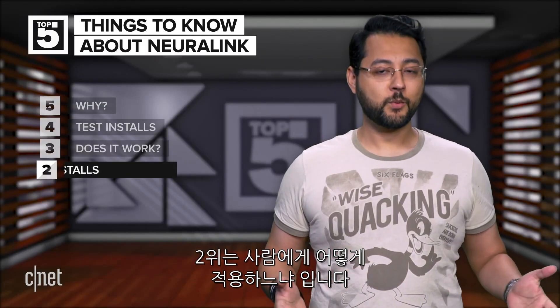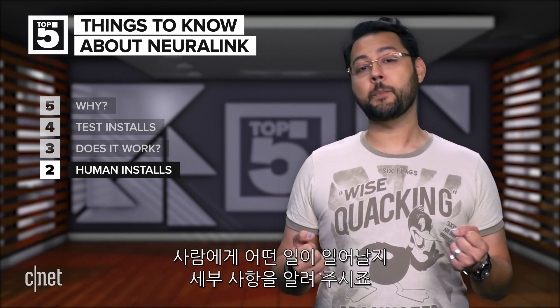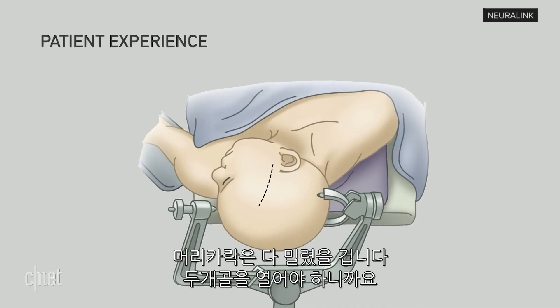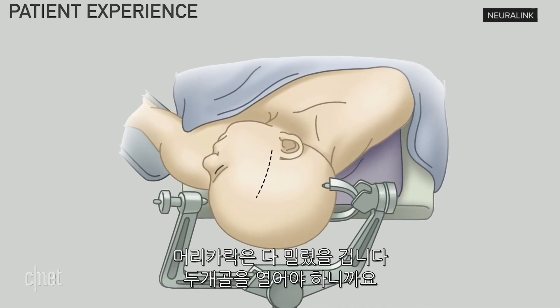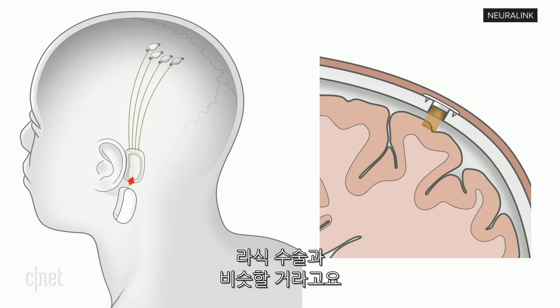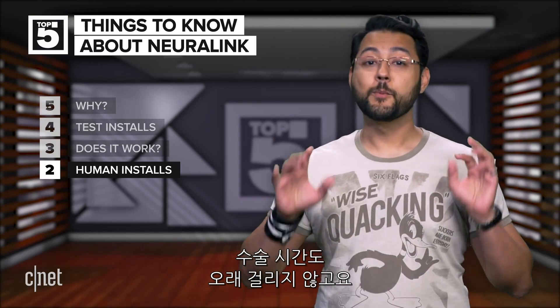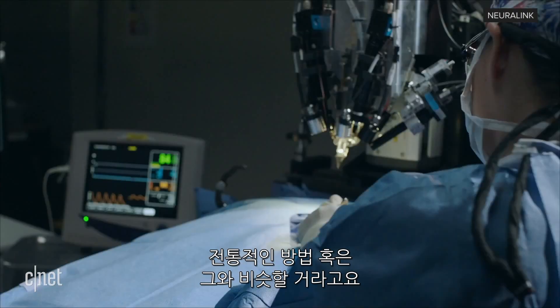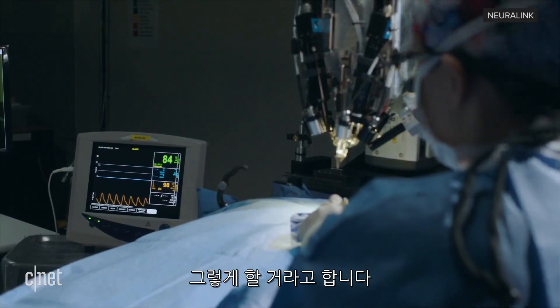Number two: how would this work on a human? You're thinking, I'm not a Long Evans rat — how does this work on humans? Normally, here's how traditional brain surgery goes: your head may be clamped in place, your head may be shaved, with scarring being a possibility. Neuralink says they want to arrive at something different. They likened it to LASIK — no big scars, no hospital stays. It would be a short procedure and you get to keep all your hair. Neuralink also says for its first clinical trials, the traditional method or something close to it will likely be used.